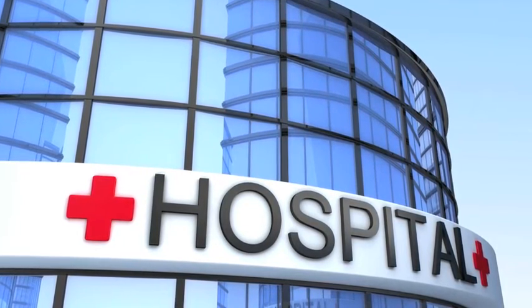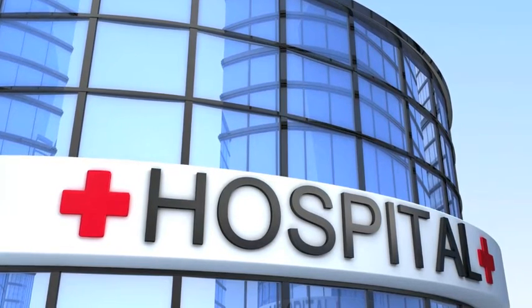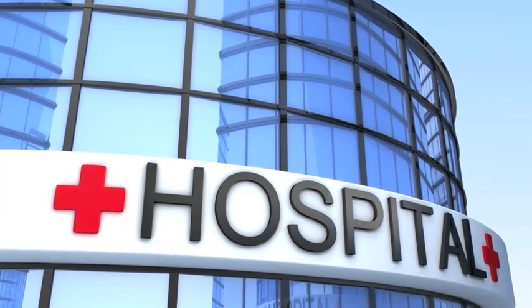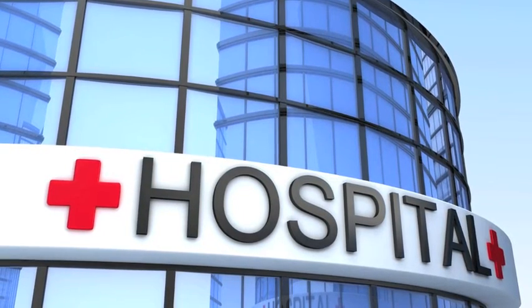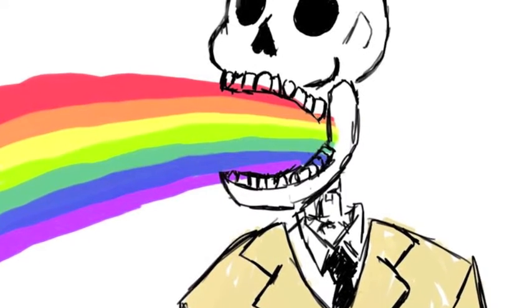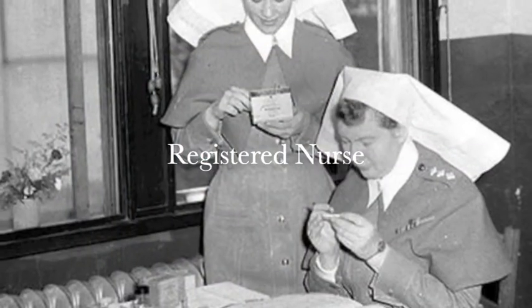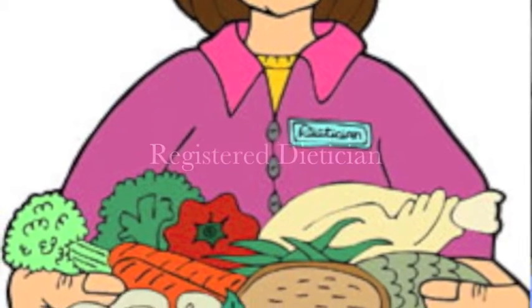NGTs are used in all patient care settings. However, they are most frequently used in inpatient facilities because NGTs are used primarily as a short-term method of providing nutrition or following surgery to reduce the risk of vomiting. Typically, NGTs are inserted and removed by registered nurses, physicians, and registered dietitians.